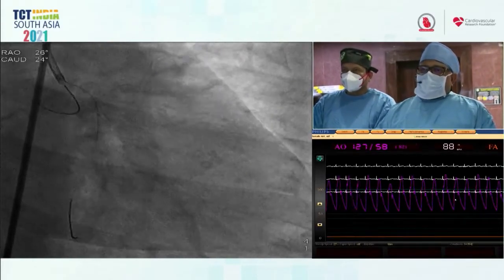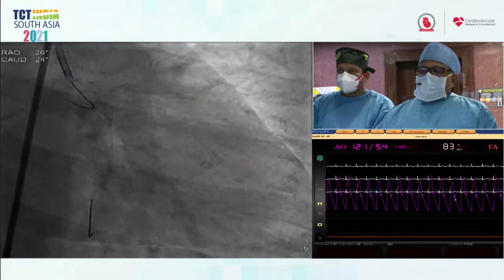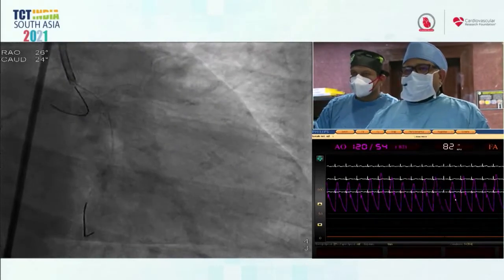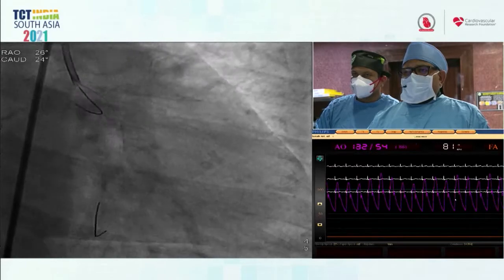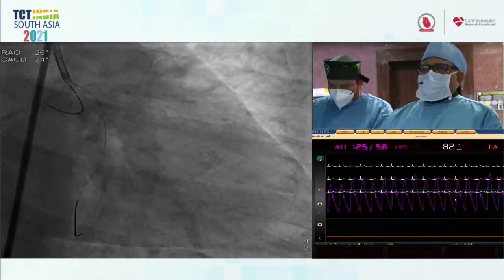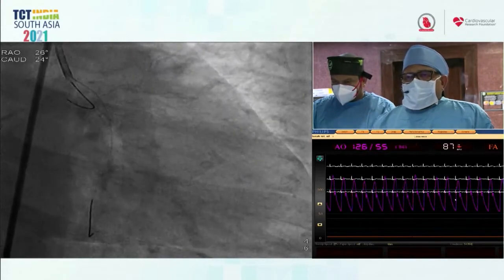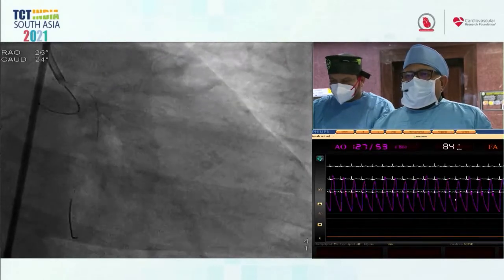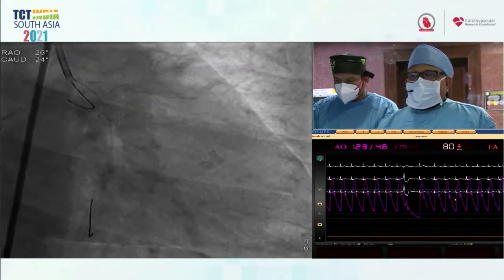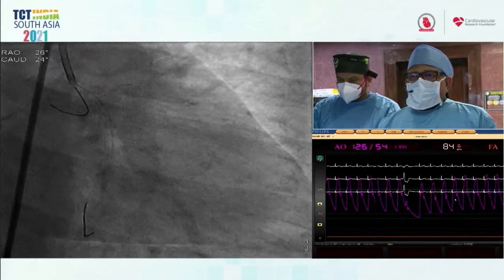So Gary, while Dr. Vijayvergiya is doing imaging, for the purpose of giving your pearls of experience and wisdom to the audience, tell us exactly what you want to see on imaging in this left main, and what criteria would say we should be doing a provisional stent here. Okay, let's start with wiring both the circumflex and the LAD, imaging from both the circumflex and the LAD to the left main, and the LAD pullback should go into the aorta with the guiding catheter disengaged. Let's start with the circumflex first. You want to see how much disease is present at the ostium of the circumflex. You want to know the lumen area and the plaque burden. Then your pullback from the LAD to the left main: how much plaque burden? Can you specify that? Sure. 4 square millimeters lumen, 50% plaque burden. Those are the cutoffs.